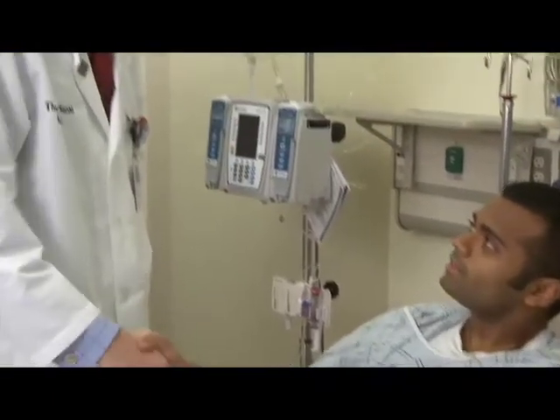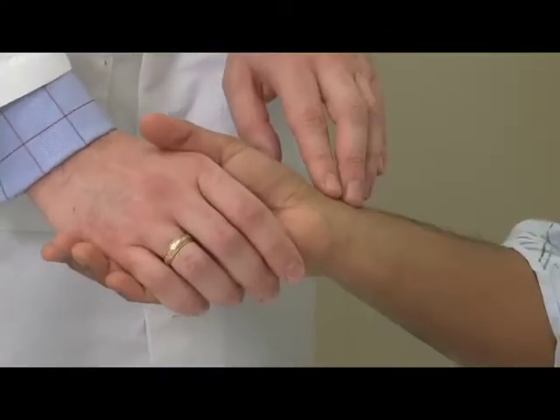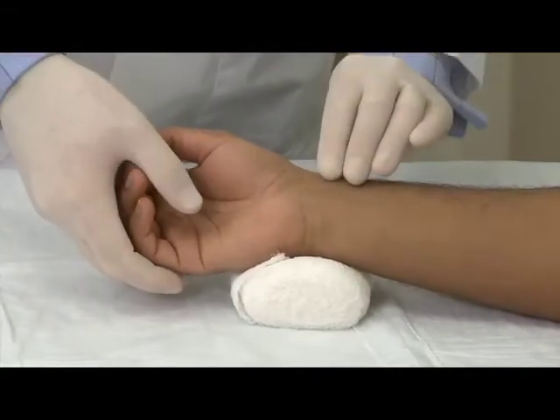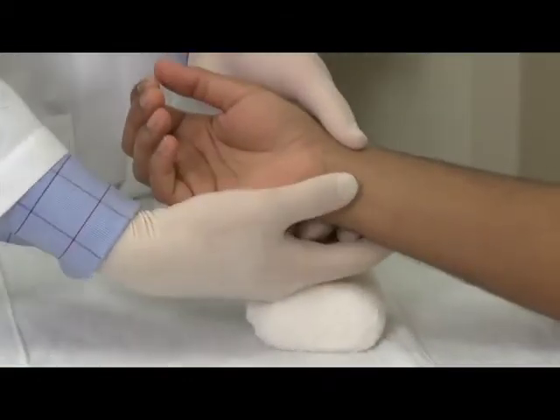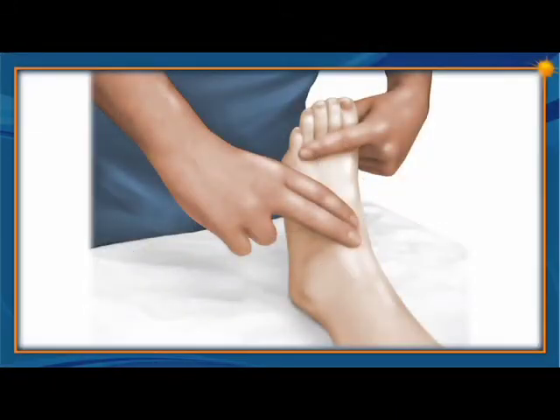Preparation for performing the percutaneous arterial blood gas sampling is to check indications and contraindications. Choose the optimal site depending on patient specifics. Check pulses and acral perfusion distal to planned puncture. Perform the Allen test or modified Allen test for planned radial artery puncture. Perform compression testing of the dorsalis pedis artery with assessment of nail bed perfusion of the first digit on the same foot for dorsalis pedis artery puncture.